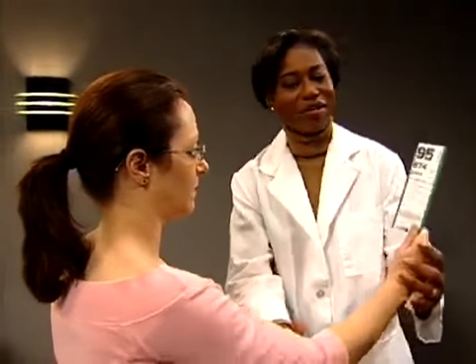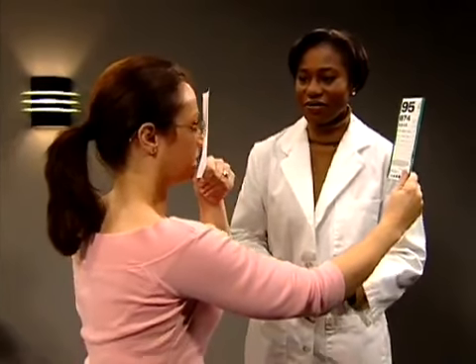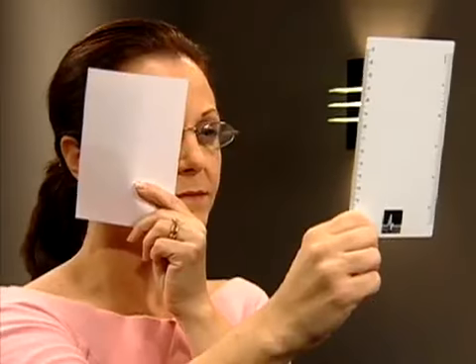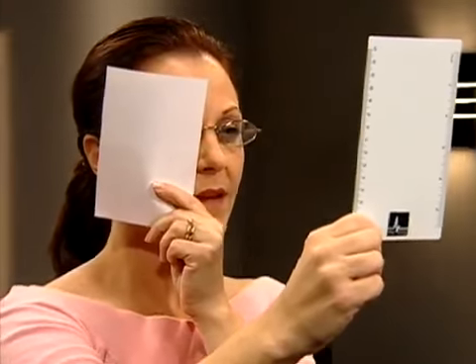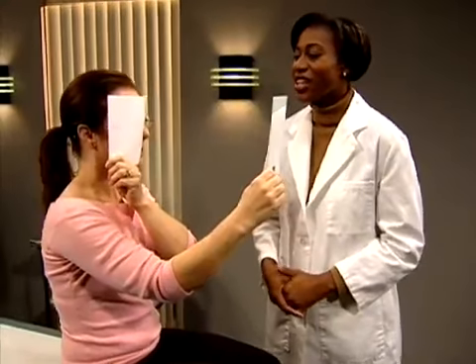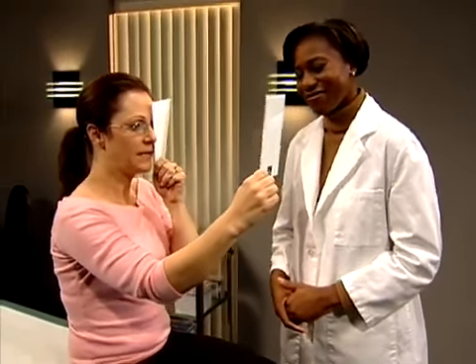Next, test the patient's near vision with a Rosenbaum pocket vision screener held about 14 inches from the eyes. Cover your right eye with the card and read the line with the smallest numbers that you can see clearly. Normally, near vision is also 20/20 in both eyes, which should be tested separately with and without glasses. 428-739. Good. Now take off your glasses and we'll try it again.